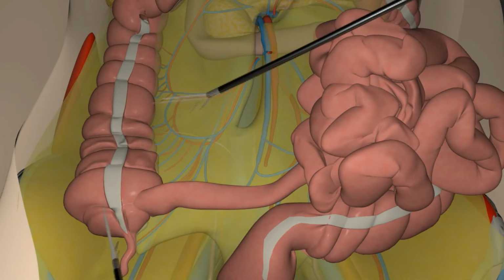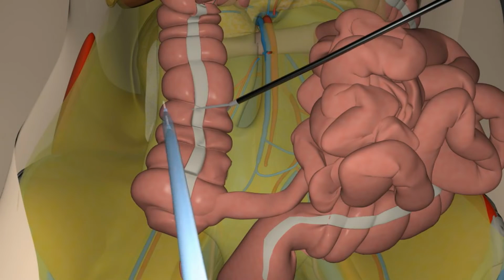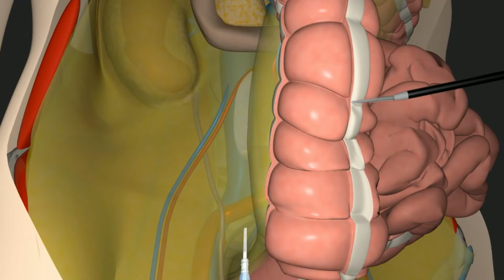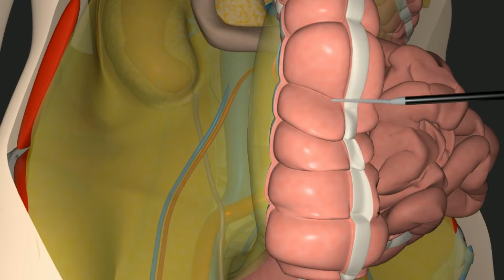The colon is then dissected completely free from the underlying duodenum and the retroperitoneum and reflected entirely to the midline. This completes the full mobilization of the ascending colon and the hepatic flexure.